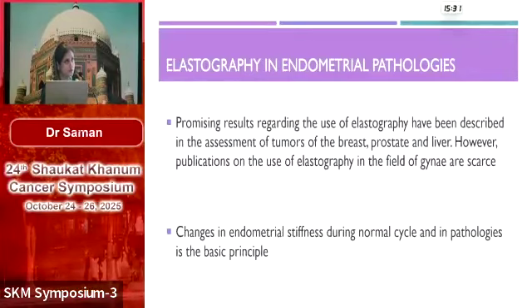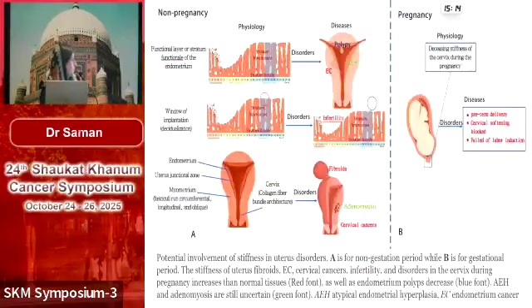And there is a difference in elastography of endometrial pathologies, which is that the endometrium changes its stiffness during the cycle. Like you have different stiffness of a normal endometrium during the cyclical phases of the menstrual cycle. So that has to be kept in mind as well.